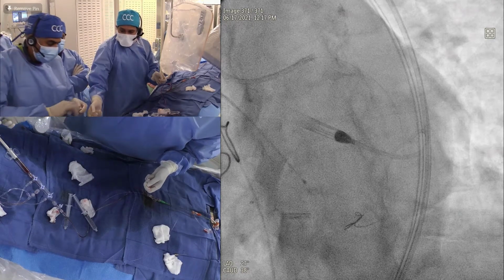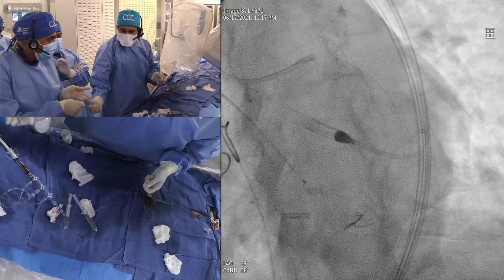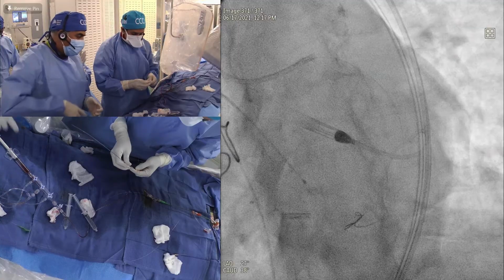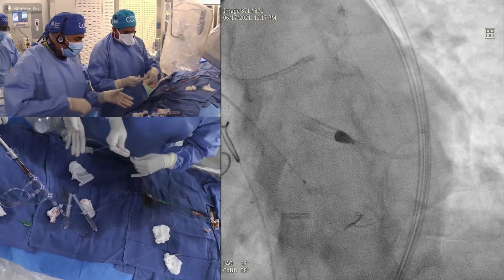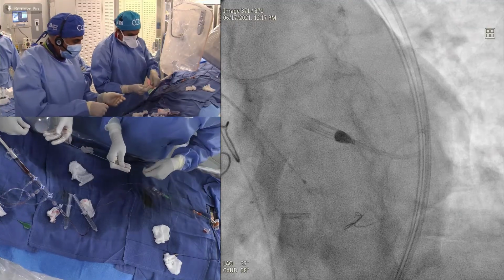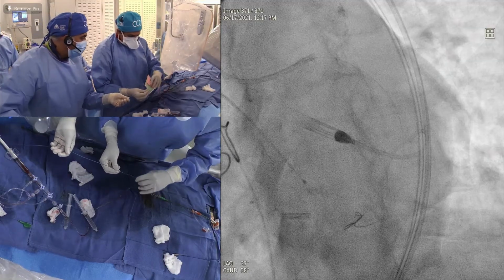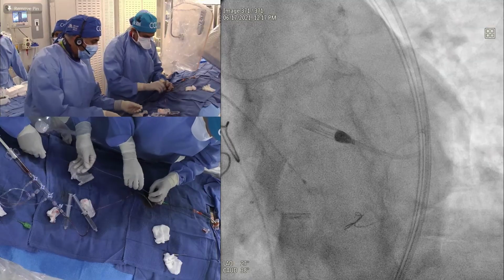And the second question is just to say that imaging, we do physiological, IFR and FFR, makes about 62% of our interventions. The national number is about 32% now. And we are at 62%. So that is one of the quality parameters which we have in our lab.